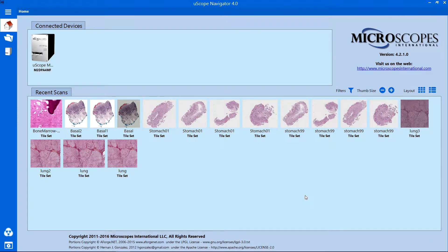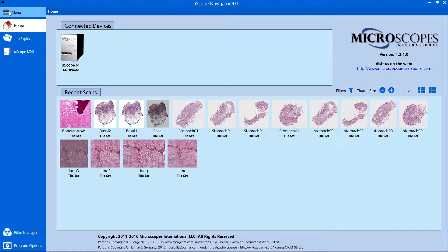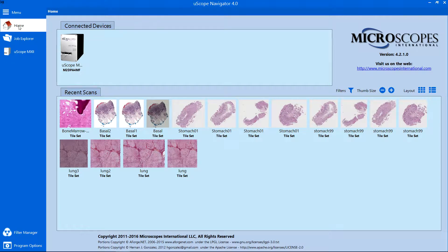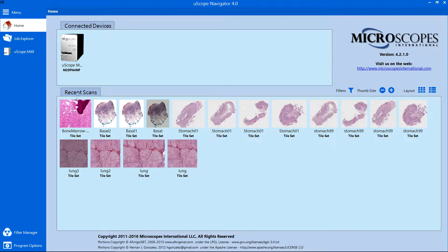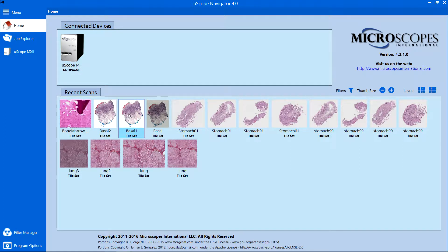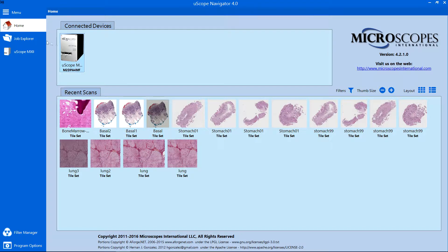When you start the Uscope Navigator application, several navigation tabs appear on the left side of the window. The Home tab displays the attached Uscope devices and the last few jobs that were scanned. You can select a Uscope or open a previous scan.